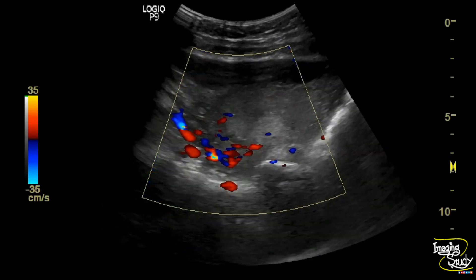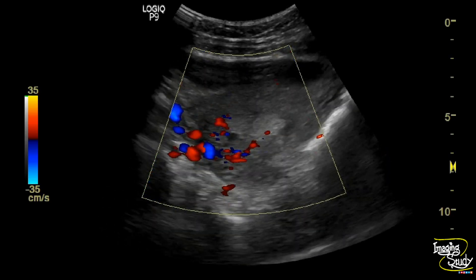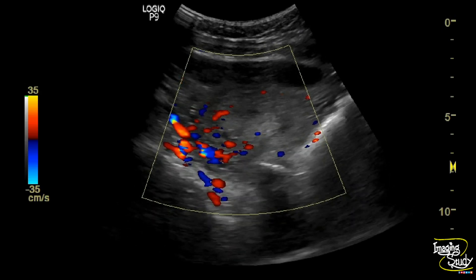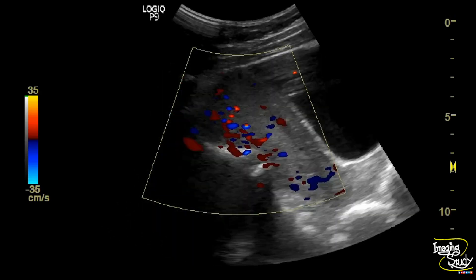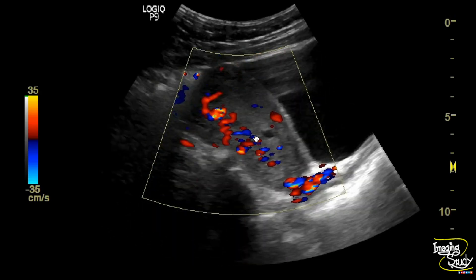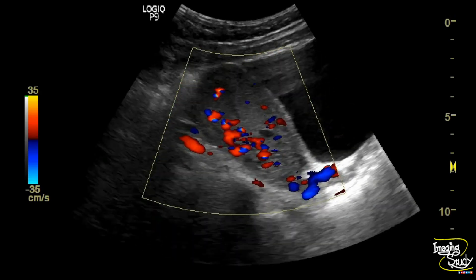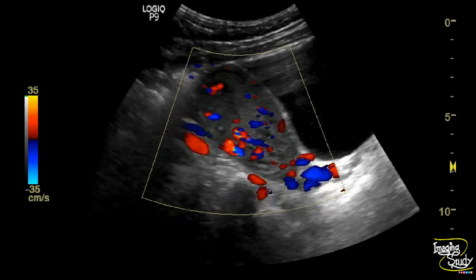So these irregular mixed echogenic substances are retained products of conception. Due to the presence of the trophoblastic layer, the color Doppler shows increased flow towards the products.